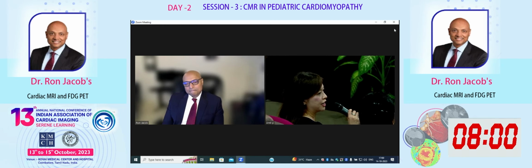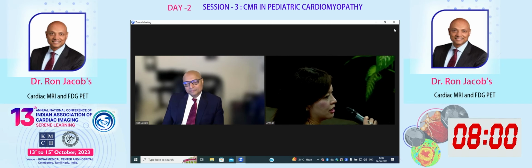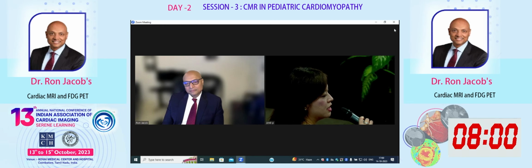To get the normal range, let's say I scan 50 healthy volunteers. Let's say Oxford, I've done a bunch of healthy volunteers over time. I know what the normal range is. I know what the standard deviation is. And I have a phantom, and I know that my method works well.